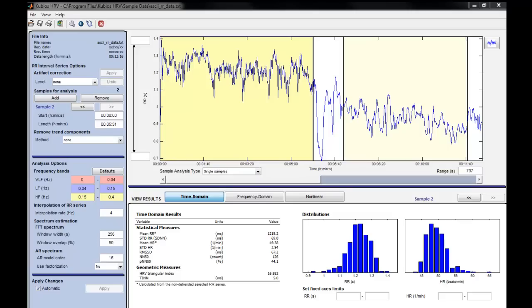Now, what does this tell us? Well, if you think about 60 seconds, which is generally how we measure heart rate in beats per minute, if you have a larger RR interval or larger average RR interval, you can presumably fit less of those within a 60-second time span. If your mean RR or average RR is less, you can fit more of them in a 60-second interval. Therefore, a greater average RR interval means a lower heart rate, and a lower average RR interval means a higher heart rate. And we can look at the data here.